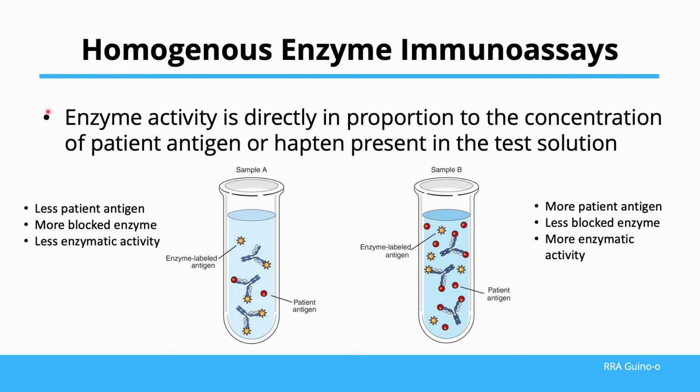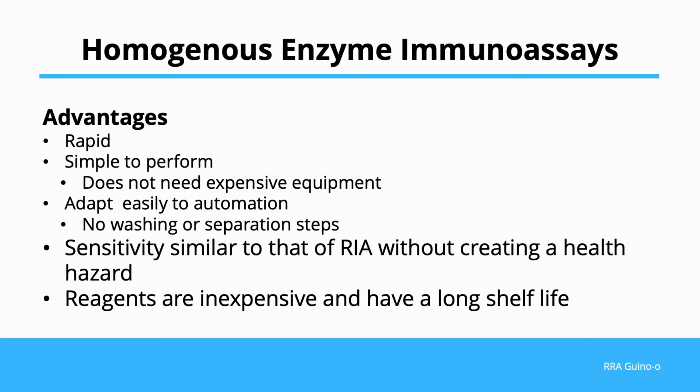This means that enzyme activity is directly in proportion to the concentration of patient antigen or hapten present in the solution. So again, the more patient antigen there is, the less blocked enzyme there is, and therefore, the more enzyme activity is detected.